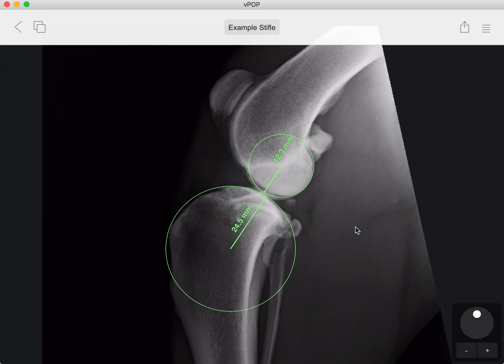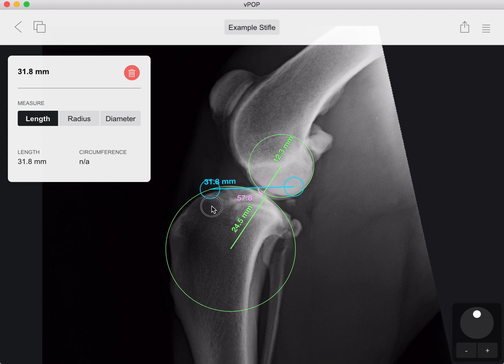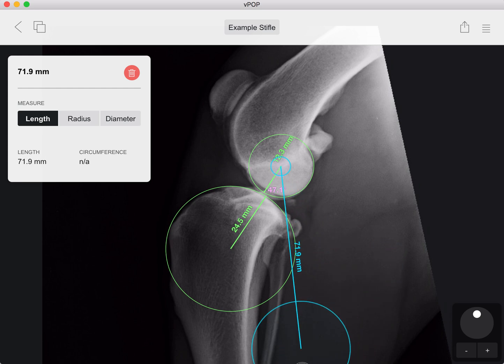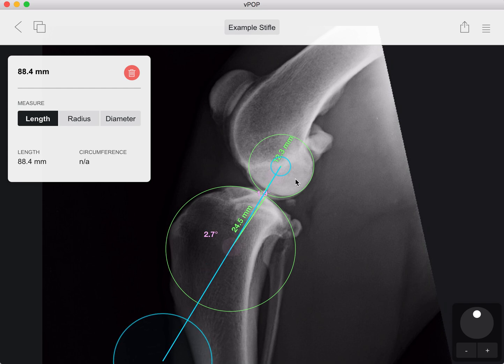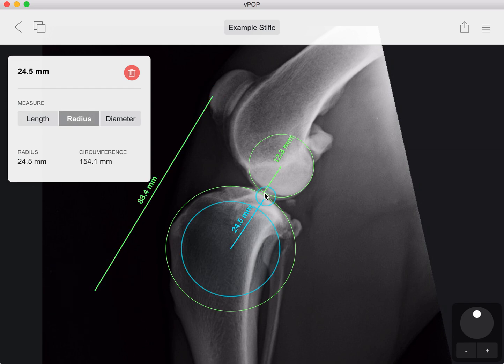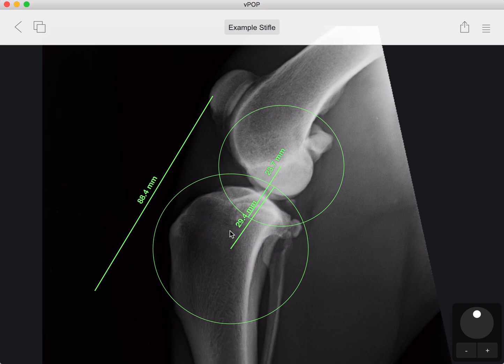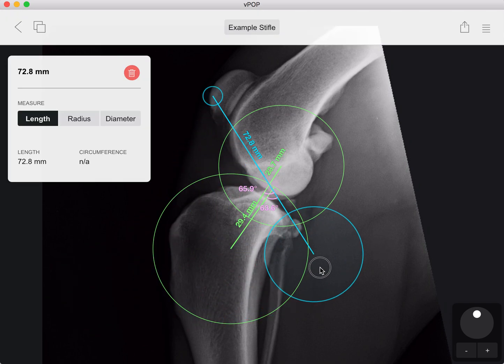Once we're finished click outside and we have our two delineated circles. We can also join the centres of the circles by going to menu, tools, distance. We can go to the centre of our circles and then if we wanted to measure the advancement for this TTA we could simply move that forward, or if we wanted to delineate our common tangent to both, we can join the intersection of both of these.